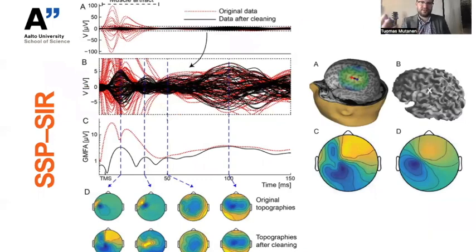Now, here you can see some TMS EEG responses that we have cleaned from these muscle artifacts. The red ones are the original signal and the black ones are after cleaning. You can clearly see that under these very high frequency topographies, we can actually uncover topographies that are much more spread out and actually do correspond to the topographies that you would expect from the primary motor cortex if we do some further forward modeling.